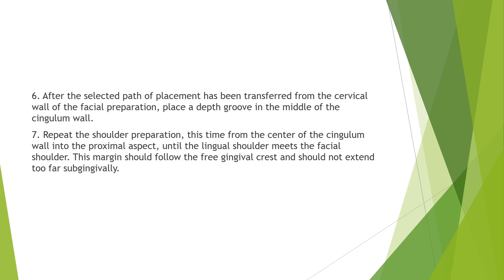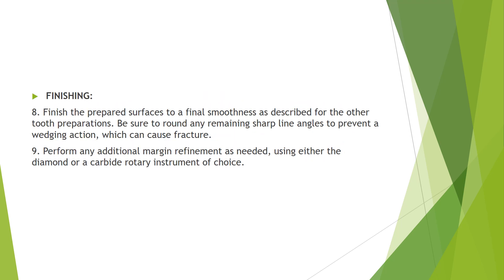After transferring the path of placement from the cervical wall of the facial preparation, place the depth groove in the middle of the cingulum. Repeat the shoulder preparation from the center of the cingulum wall into the proximal aspect until the lingual shoulder meets the facial shoulder. The margin should follow the free gingival crest — follow the gingival contour and do not over-extend. Finishing is done with finishing burs, with all line angles rounded off to prevent fracture, and any additional margin refinement is performed as required.